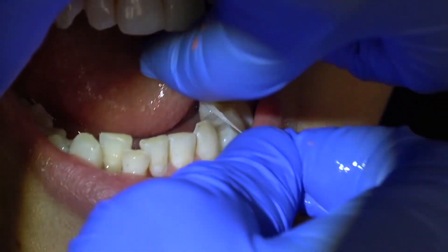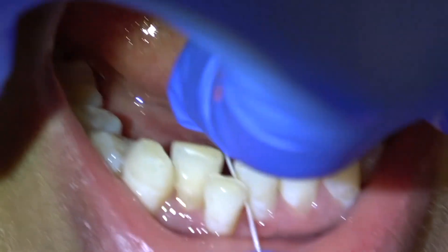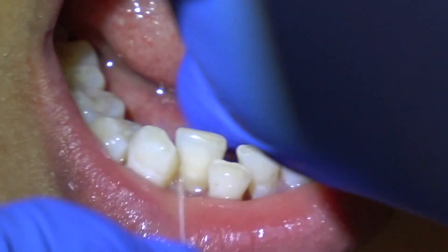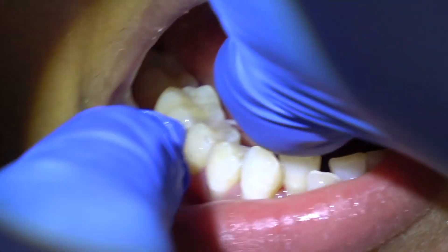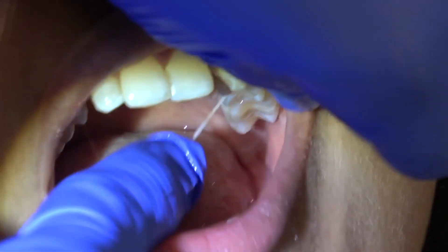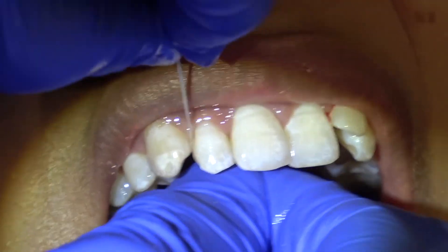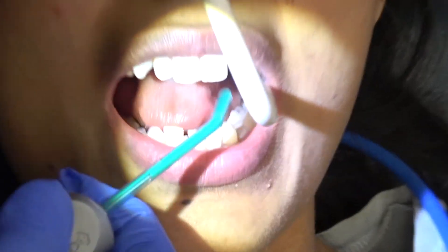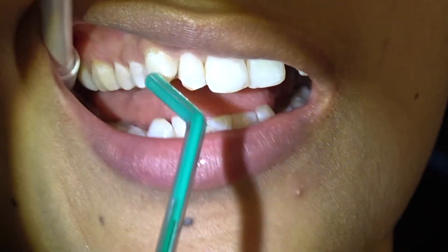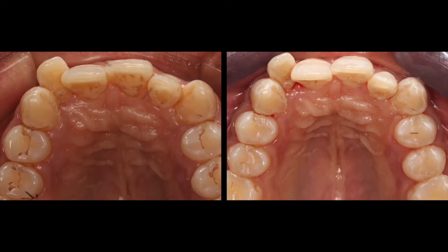The hygienist is not going subgingival at this appointment because I did all of that while the patient was anesthetized and sedated. She's just fine-tuning the supragingival, mainly stain — there shouldn't be any plaque on the teeth — and then reinforcing proper home care. You can see how much better they get. There's a little bleeding, but that will go away within a week if the patient is executing proper home care.